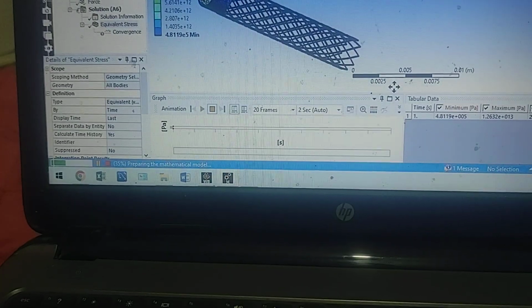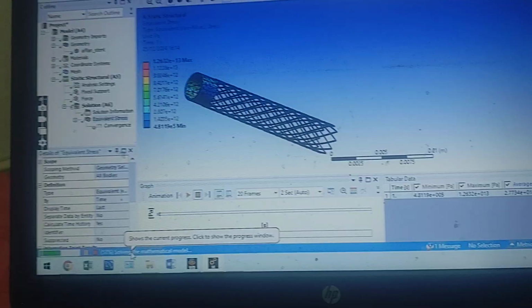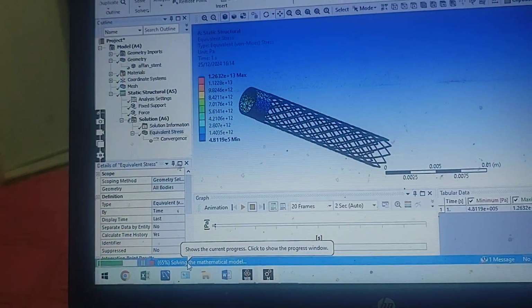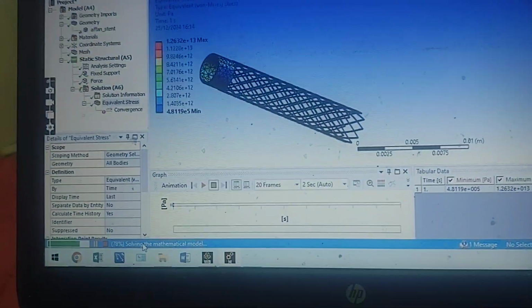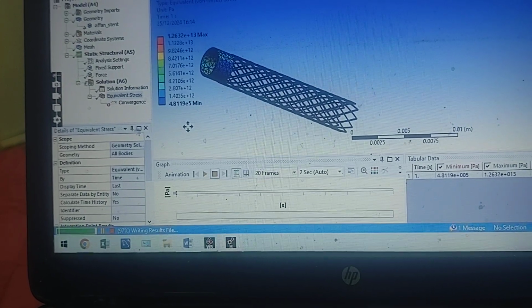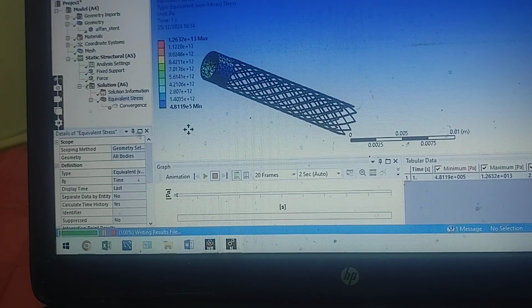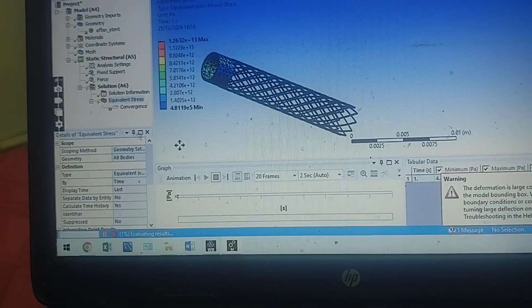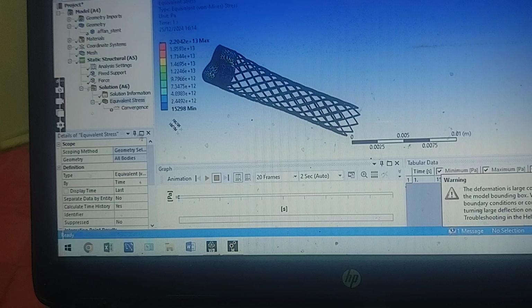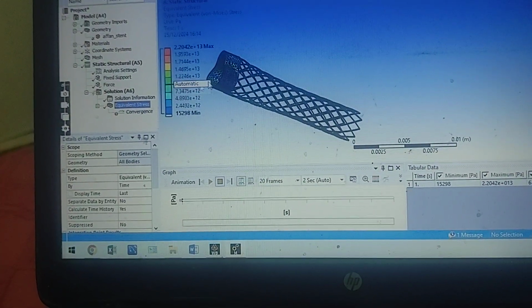So this is not for you. It will take time. 53%. Once it's solved, I will tell you the exact result for maximum von Mises stress, or 100% writing result file. So yes, this is not converging. Why? When it converges, it will show a horizontal line. So it's up to you whether you want to converge or not.